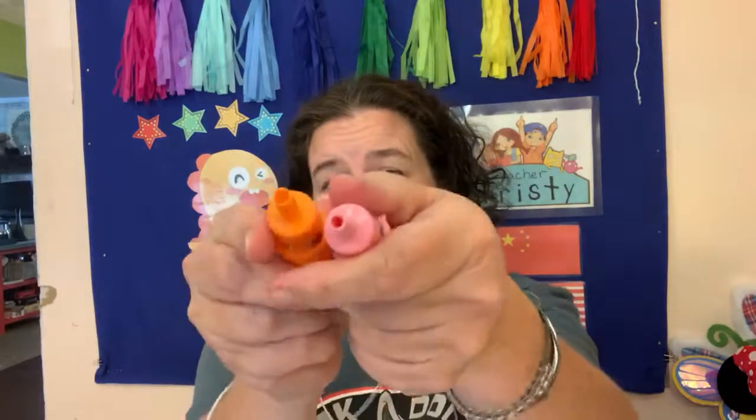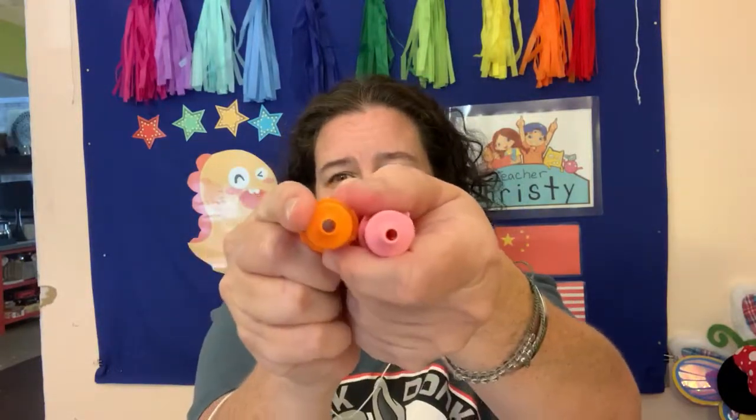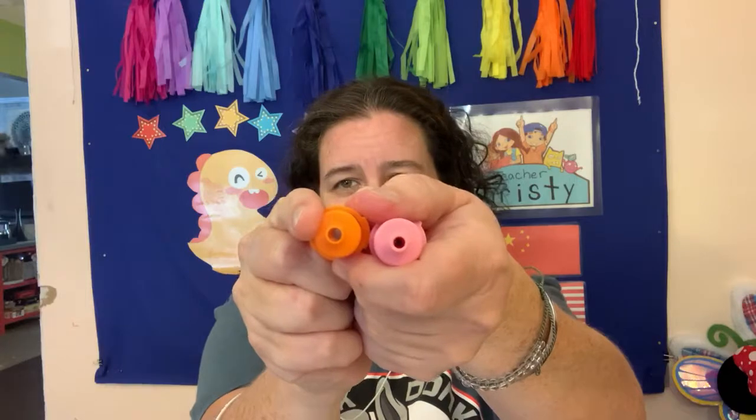All right. So, Venturi devices. All right, so the Venturi device uses orifices. Oops, I keep forgetting where my camera is on this device. So, the pink device has a bigger orifice than, let's say, the orange. Yeah. So if you look down, you can see that orange is definitely bigger than pink, right? So these are other gas law Venturi principles and Bernoulli principle, which we'll get into in class.